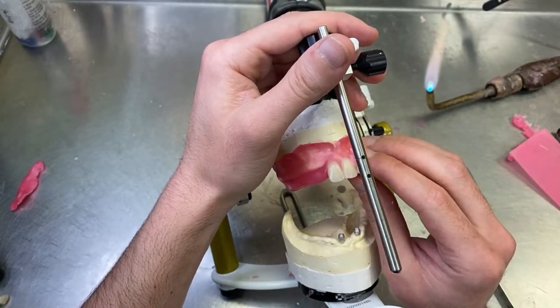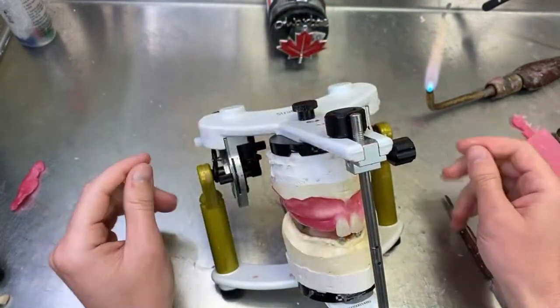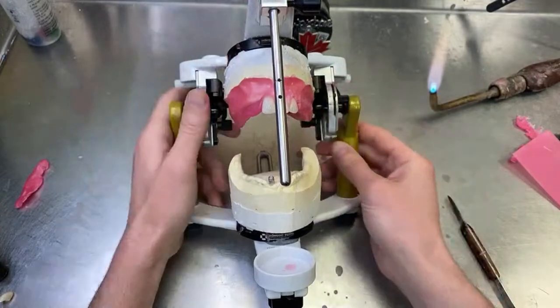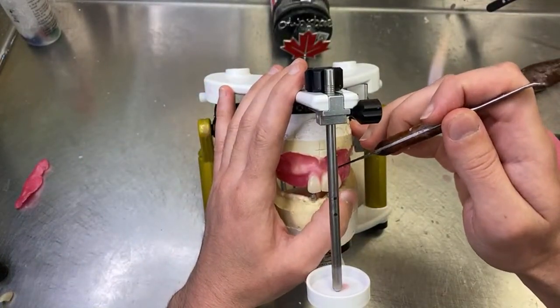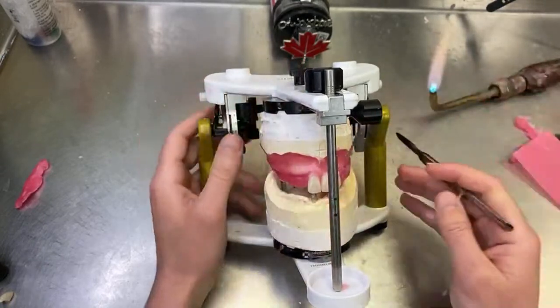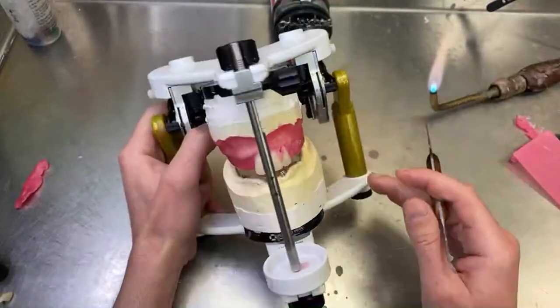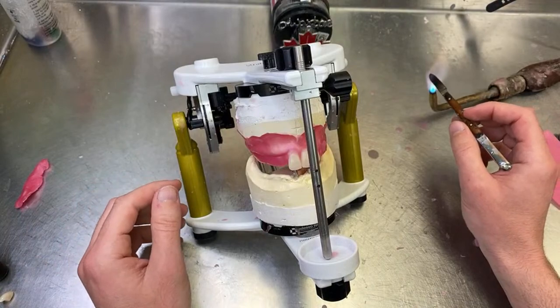So based on the information that I have, this patient is female. The reason that we check for those is that you wanna give a feminine look to a female patient, and you want masculine looks, of course, based on what they want. So with this female patient, I'll be looking at that lateral flare, and also based on age.